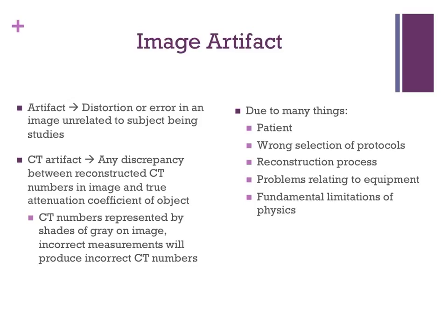A CT artifact is any discrepancy between the reconstructed CT numbers in an image and the true attenuation coefficient of the object. So basically, anything that causes an incorrect measurement of transmission readings by the detectors or an inconsistency between the measurement and reconstruction will result in an image artifact.